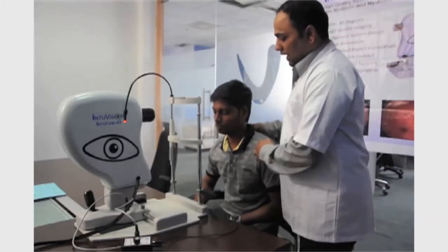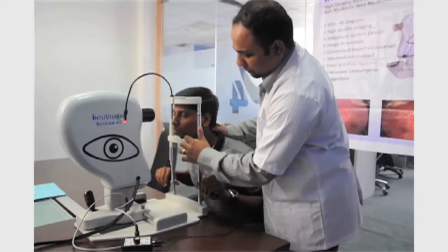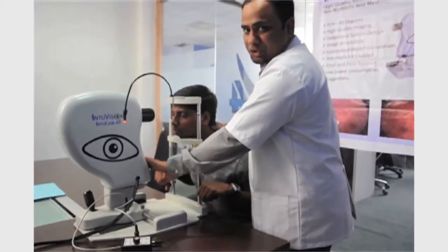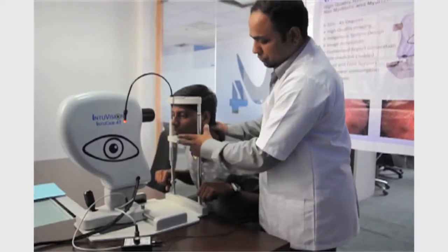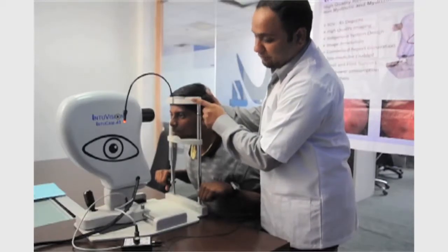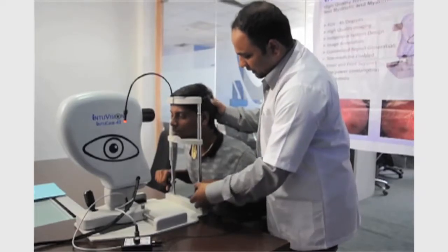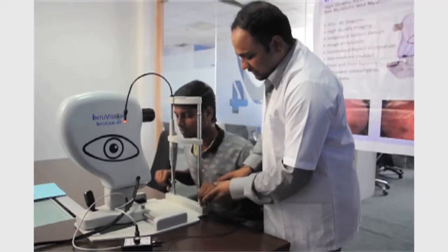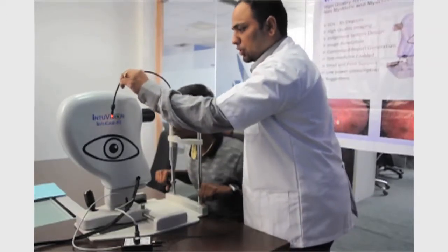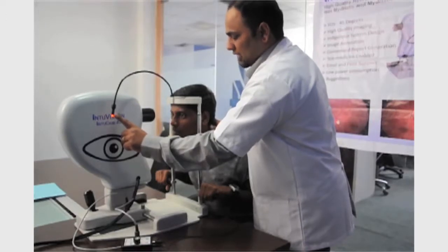First, we will have the patient put his chin on the chin rest provided here. Before that, ensure that the device is in the backmost position. Once the patient places his chin on the chin rest, press his forehead against the forehead strap and ensure that the patient holds the stand on these handles. Ask the patient to continuously look at the red light here without moving his eyes.